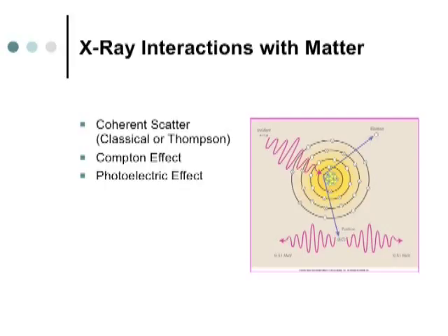Okay? So the only difference between an excited molecule and an unexcited molecule is vibration. So when the X-ray passes through, this happens in mammography a lot, lower than 30 kVp, we produce coherent scattered radiation. The X-ray passes through, the atoms get excited, they vibrate, they absorb the energy, and then they release the energy as they decrease in their excitement.